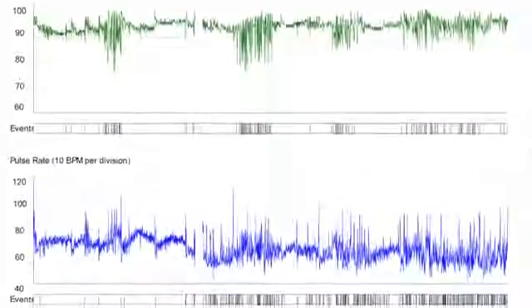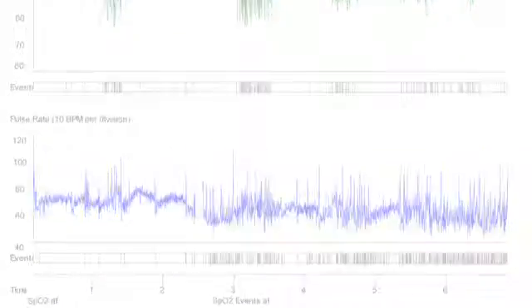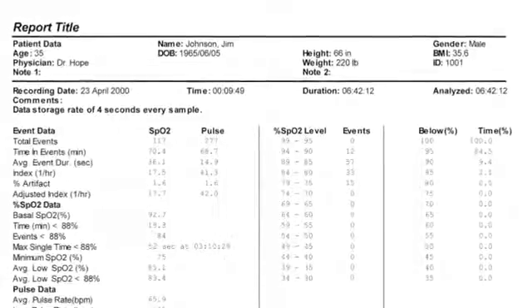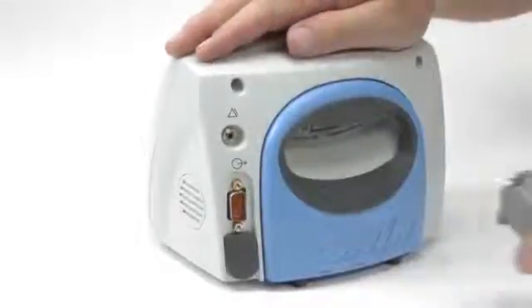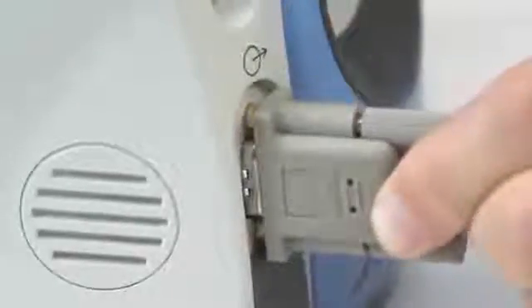The Avant 9600 stores at least 115 hours of continuous arterial oxygen saturation and pulse rate data. This data can be transferred and analyzed in Nonin's N-Vision software via a modem cable from the oximeter to a computer with N-Vision installed.